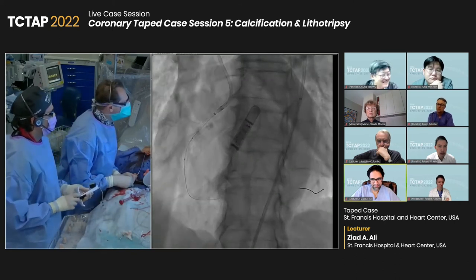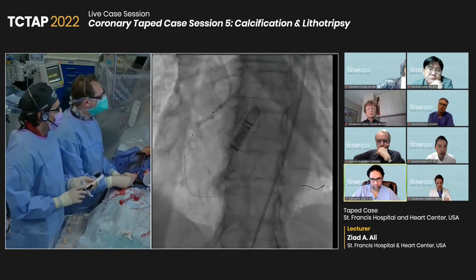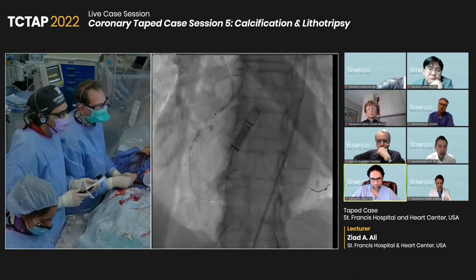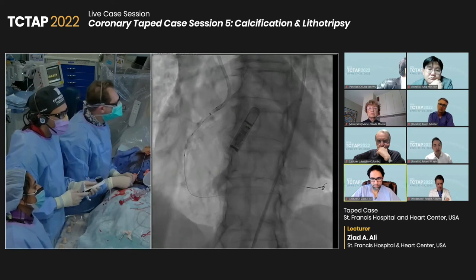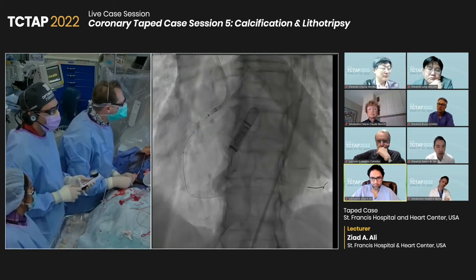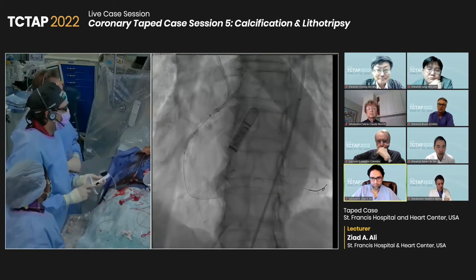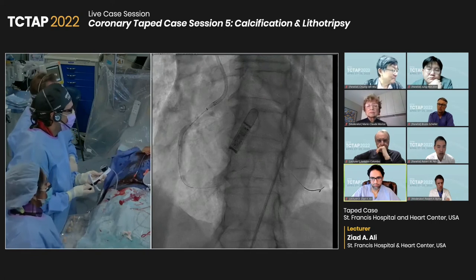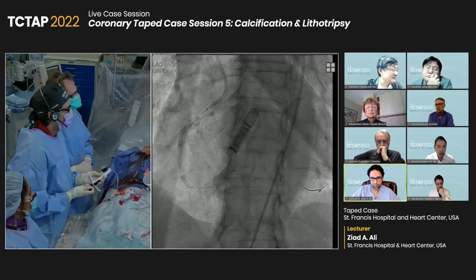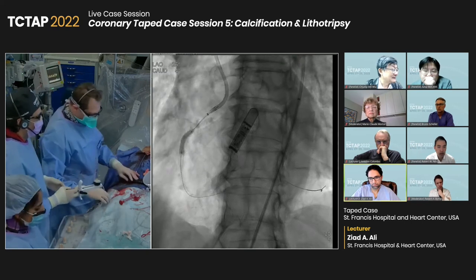I'm coming back a little bit. I think this is good, right? Or no? Let's see. Is the device detection on? It's missing it a little bit. You want to redo our device detection? Okay, never mind. I think it's good. Cancel, let's take this. 20. Isn't it? Oh, I like that. All right, I have a little room proximal.